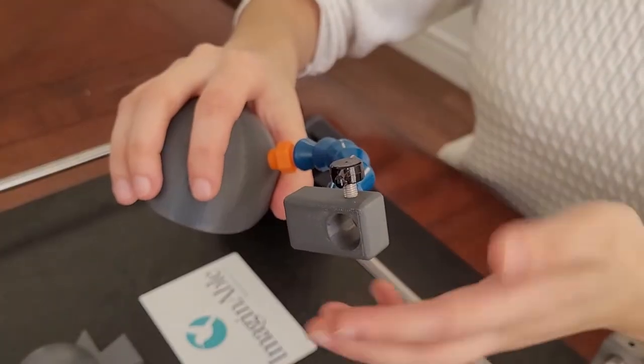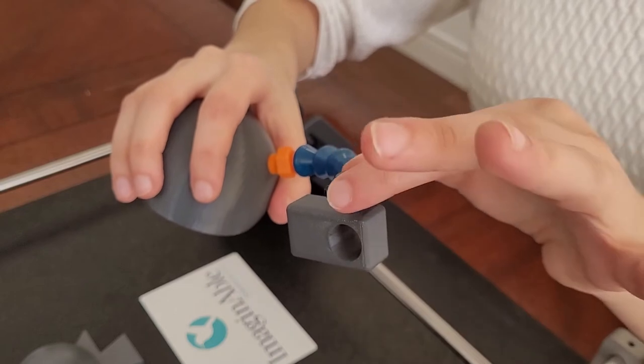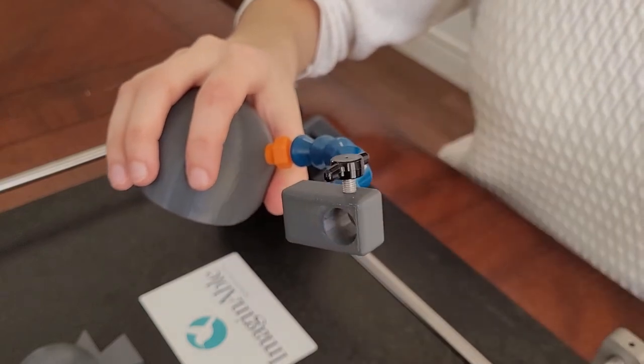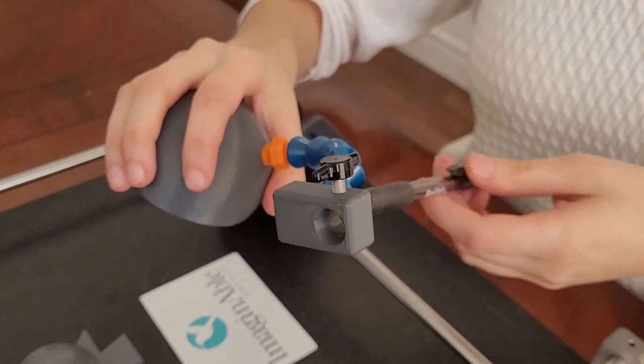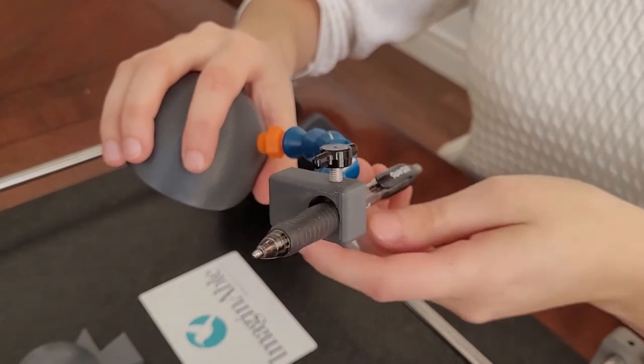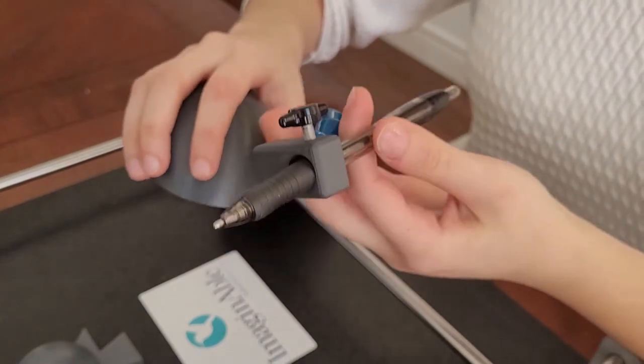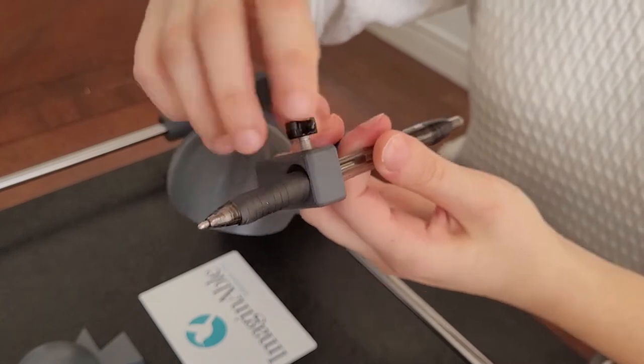The utensil arm is connected to a utensil holder, which includes a thumbscrew to hold our utensil into place. As an example, we are going to use a pen. Insert the pen through the hole and secure the utensil into place by turning the thumbscrew clockwise until it feels secure.